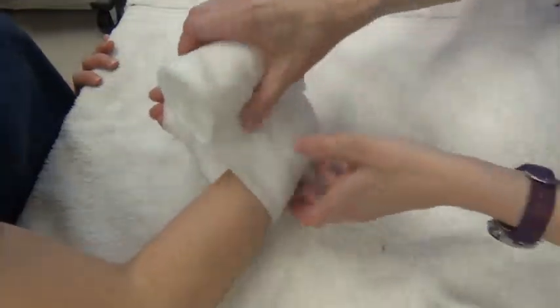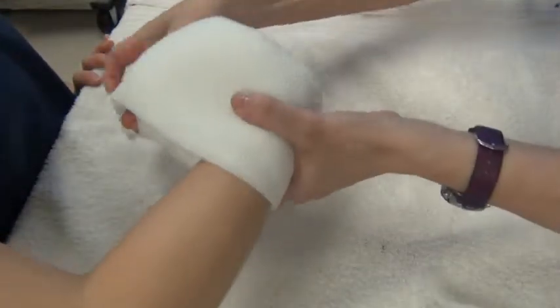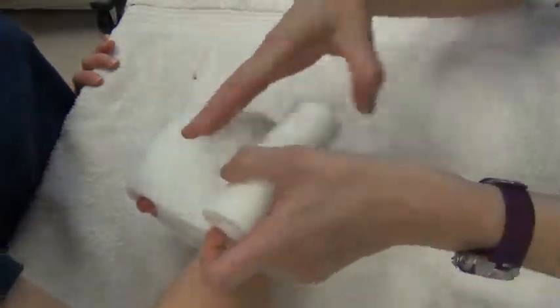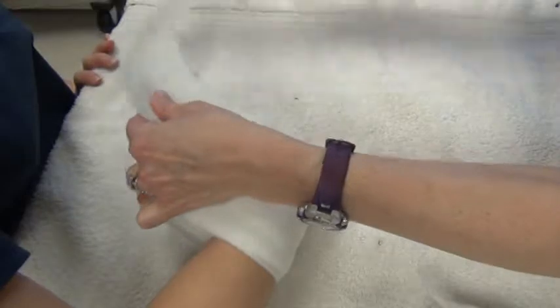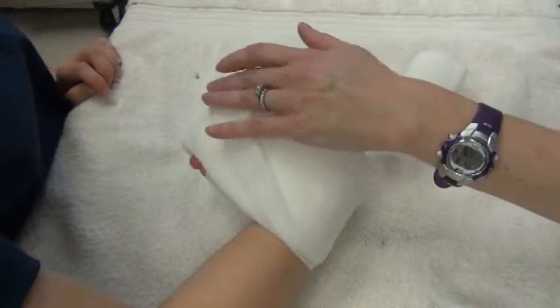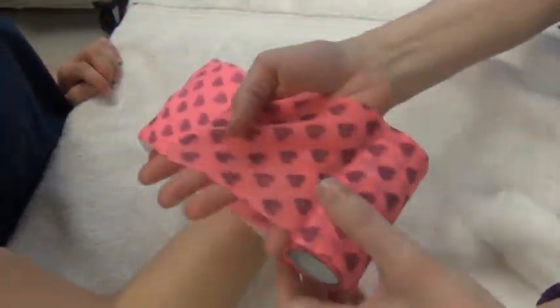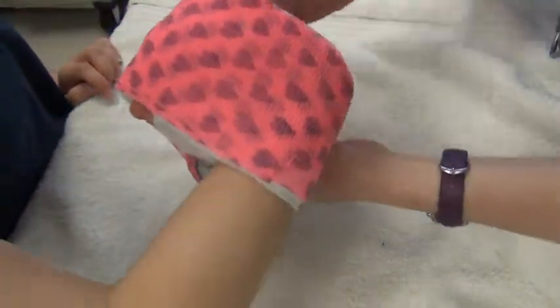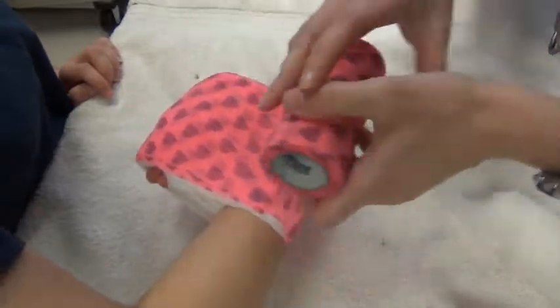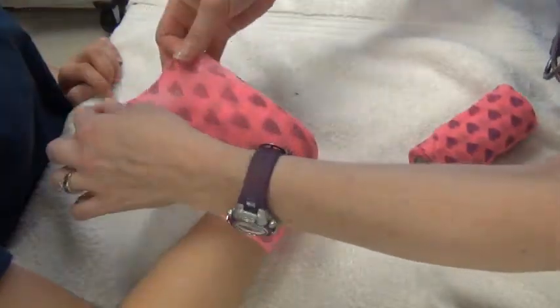And this is to immobilize the carpus joint. So we use the cast padding first, and you would get that as closely and as tightly as you could next to the leg. And it's a little bit harder for people, I think, to flex that than animals. So we're going to do the cast padding first, and then we're going to finish with the vet wrap. And her toes, her fingers, are still exposed. And that's the application of our carpal flexion sling.